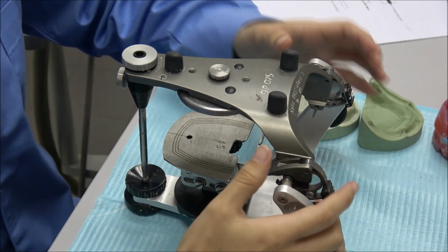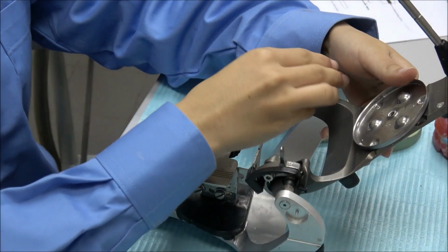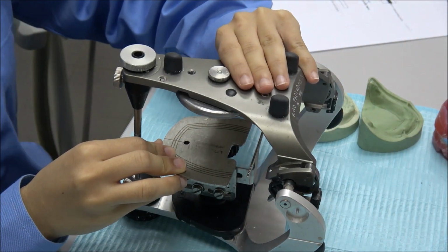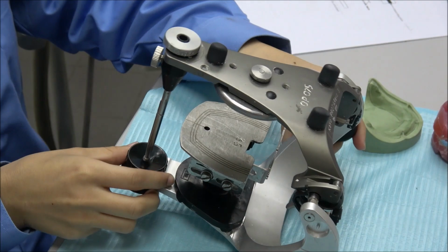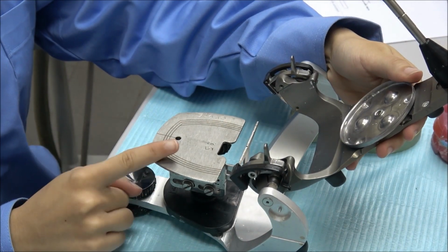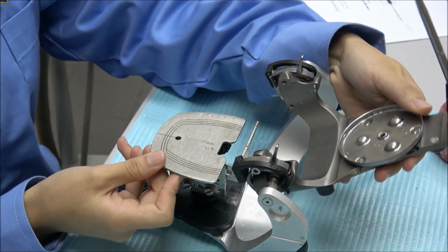So if right now mounting, we have to lock it, make sure it's locked to prevent any moving when we mount. Okay. One more thing here. This is our occlusal table. Okay, we use it to mount our upper models.